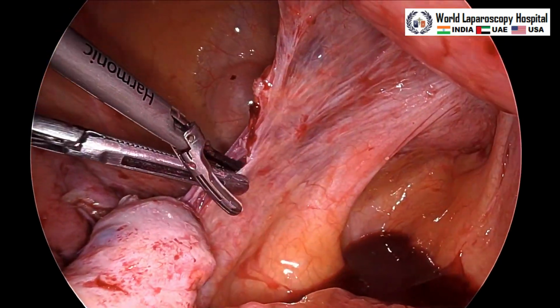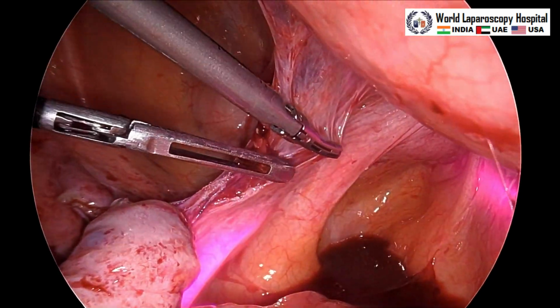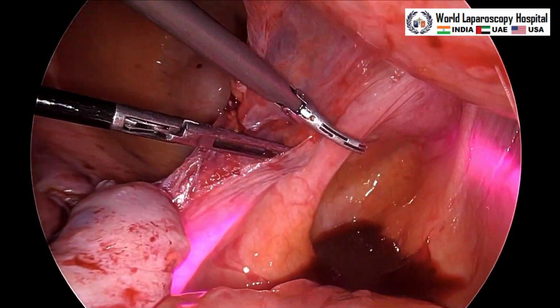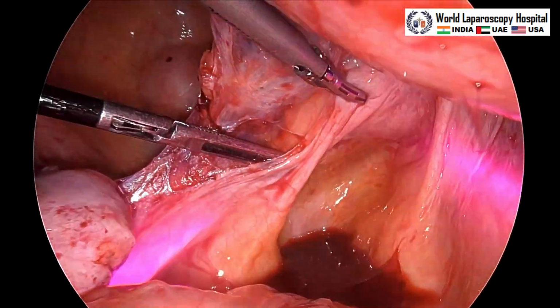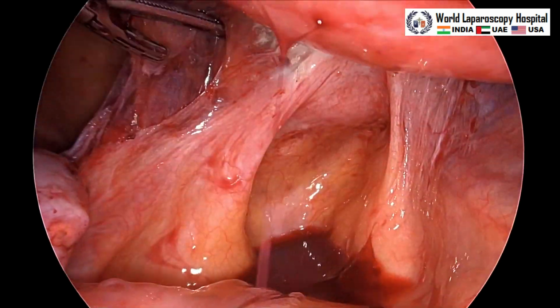After that, we will put the uterus at the 1 o'clock position, and this is the posterior peritoneum of the left side. The left hand is very important because it will keep the peritoneum stretched, and we will go from above the arc of the uterosacral ligament.